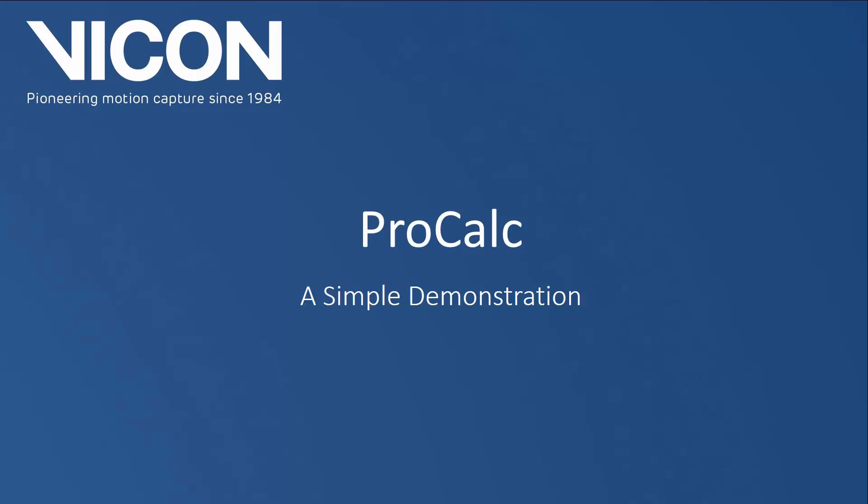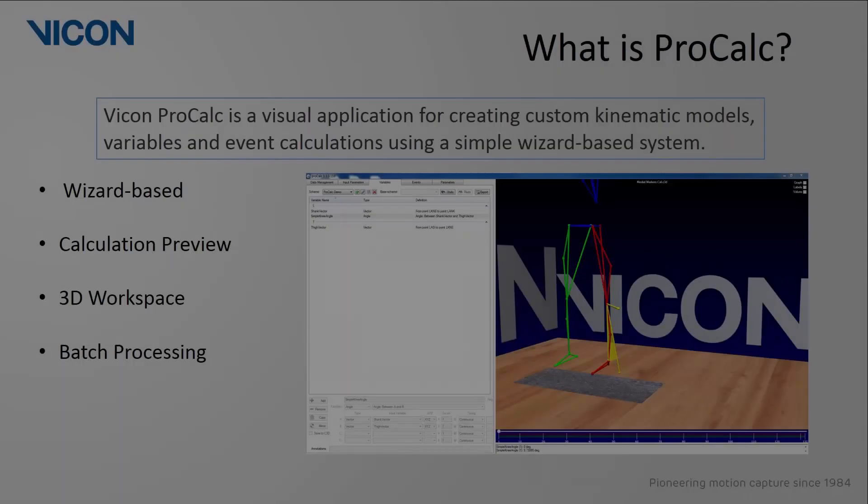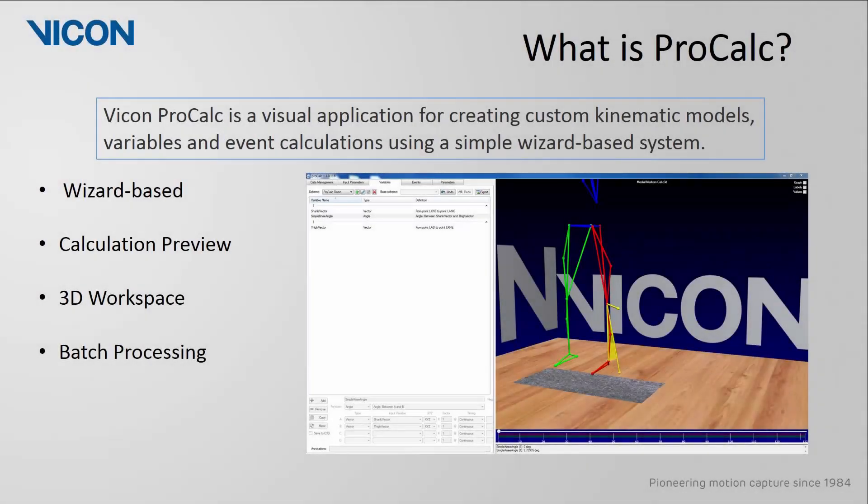The following video is a simple demonstration on how you can use ProCalc to perform some simple calculations on your Nexus data. ProCalc is a visual application for creating custom kinematic models, variables, and event calculations using a simple wizard-based system. This means that all calculations are performed using drop-down boxes, which guide you through the process.